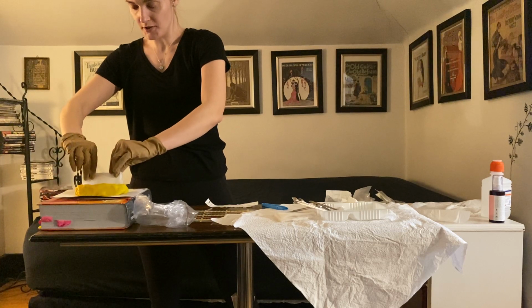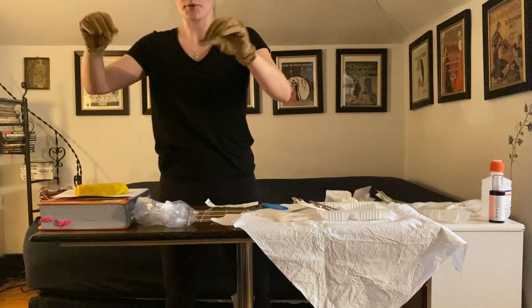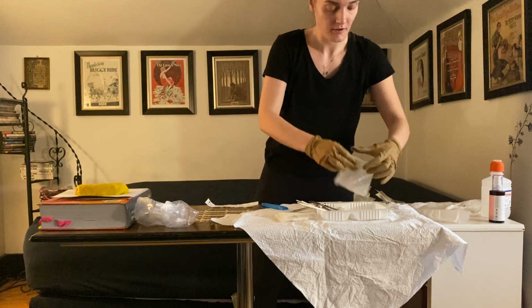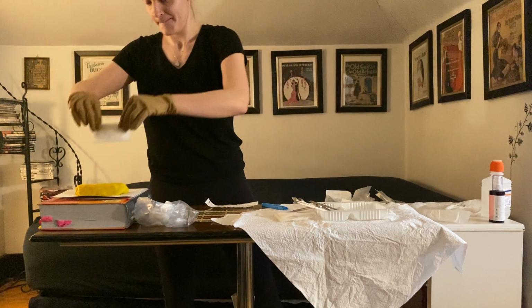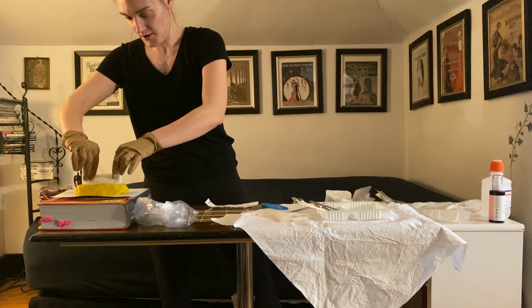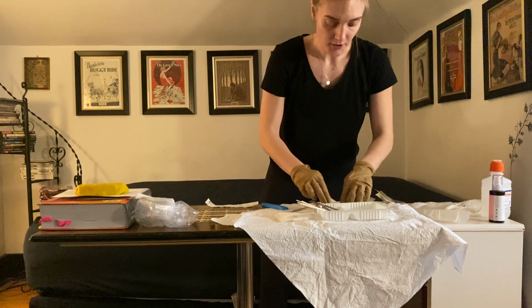So just gently putting that in. That's going to sop up, and then disposing of that before it's able to touch my gloves. And then there's still a bit more water, so I do want to use another one. So, it should be about as moist as an eyeball there, so disposing of that. And now I need to clean my peri wound.